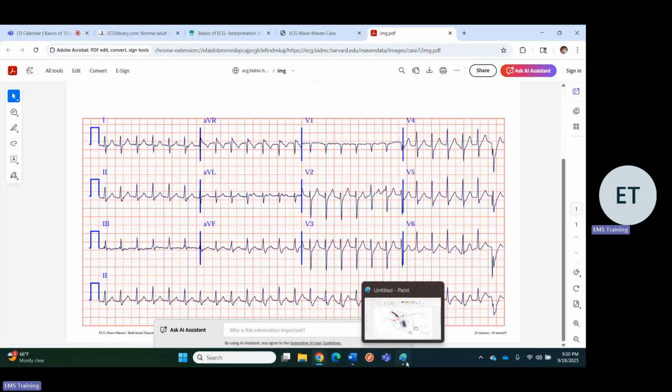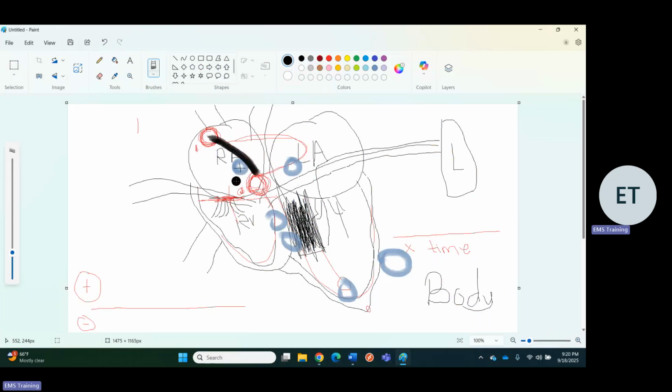Anyways, what I was getting at here was that if you have something originating here, originating here, originating here, because it's not super wide, wherever it's originating, it's kind of high up. This bends the axis. If instead of being here, it's a little bit rightward, well, that's pushed to the right, isn't it? It's originating here. That's literally to the right. That could cause slight right axis deviation. It's not like this, but it's more rightward. So something like that.